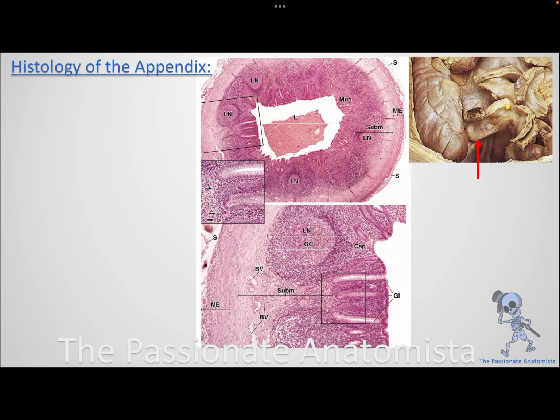All right, and this is another real histological picture. If you look at the epithelium itself, it will look like the colon, and then you have so many lymphatic nodules, the aggregation of lymphatic cells with the germinal centers, and these are the active parts of the lymphatic nodules. And if you look at the epithelium itself with these crypts, and the glands themselves, same as the colonic glands in the colon. You will find that the epithelium is exactly like the colon. It means this is part of my colon, the appendix. But I have lymphatic nodules. It means this is appendix.